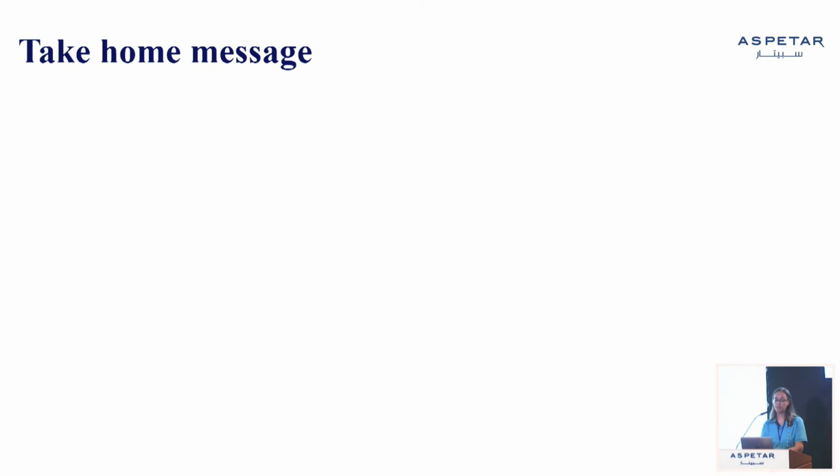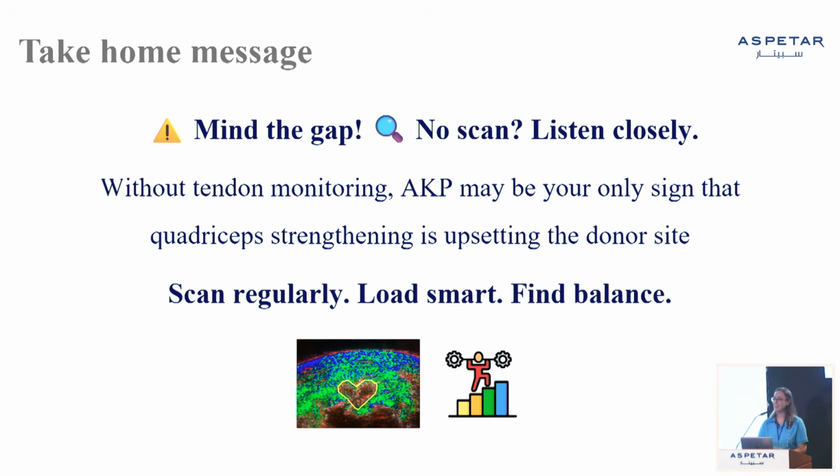The take-home message is mind the gap. If you don't scan, listen closely. Without tendon monitoring, anterior knee pain might be your only sign that quads strengthening is upsetting the donor site. So scan regularly, load smart, and find balance.